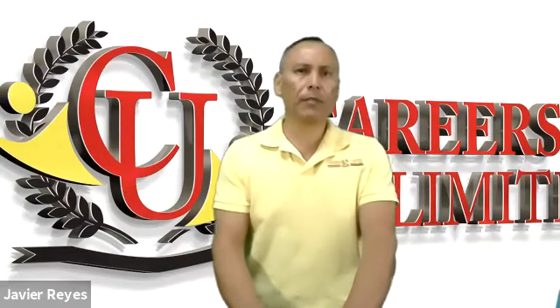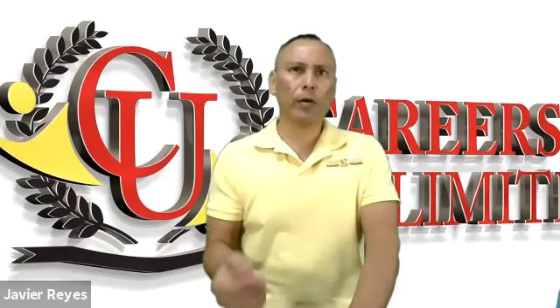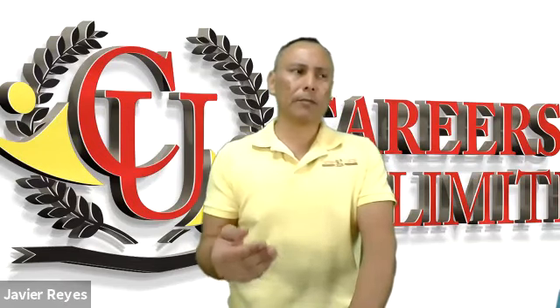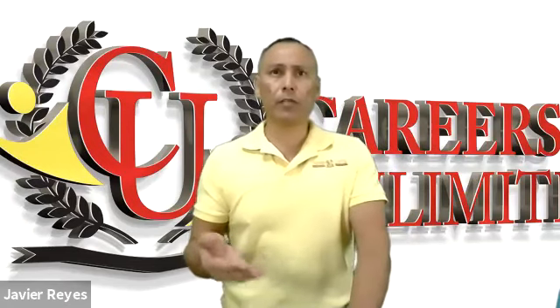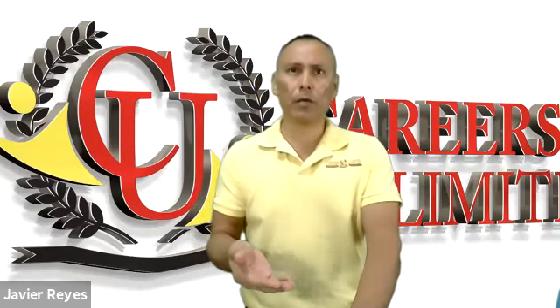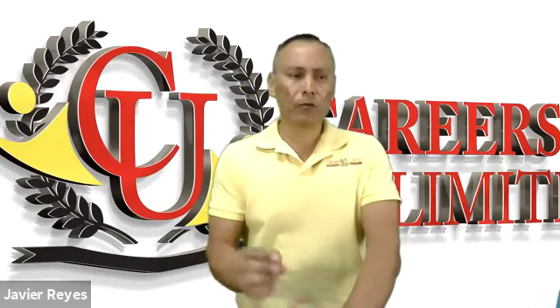Now, even if it's an old tattoo, when someone has an old tattoo and you puncture the area, and that person happens to have some kind of bleeding under the skin, it's going to be difficult to visualize because a bruise almost looks like a tattoo, so it may be difficult to catch it right away.